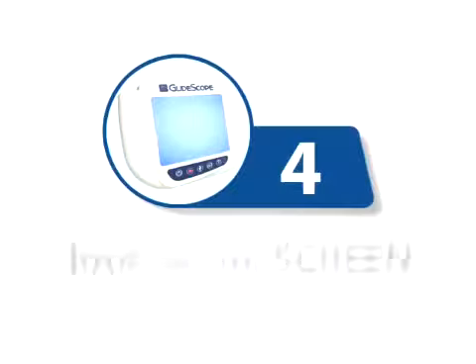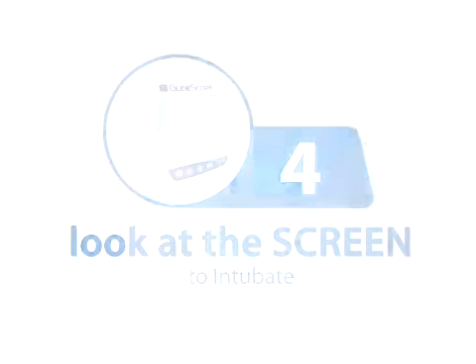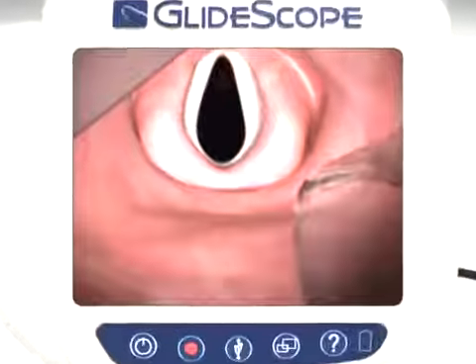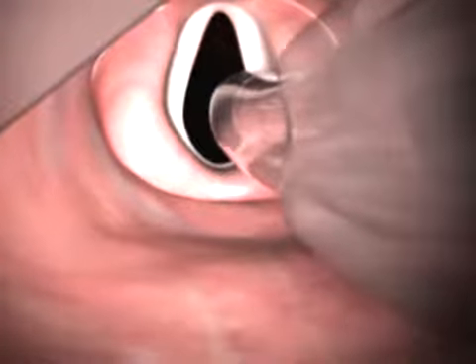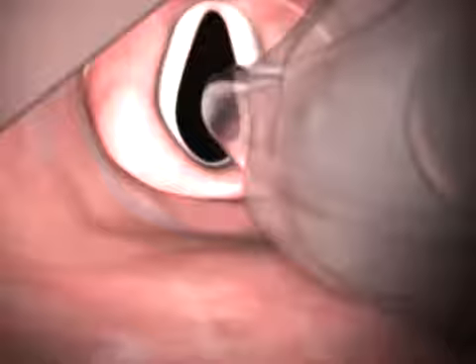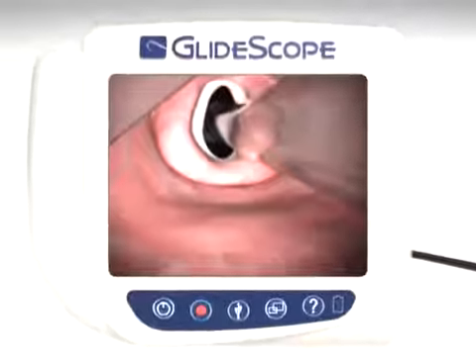In Step 4, focus on the video monitor as you advance the endotracheal tube. Returning your eyes to the video monitor gives you a view of the glottic aperture, and near it, the tip of the endotracheal tube. Sometimes a slight withdrawal of the GlideScope is required to reduce the viewing angle and allow the glottis to drop. The tube is then advanced by gradually withdrawing the stylet 5 centimeters as the tube moves forward. Viewing the entire insertion step on the video monitor allows you to quickly and gently rotate or angle the tube using the right hand to redirect as needed.